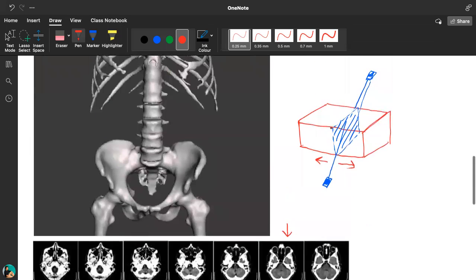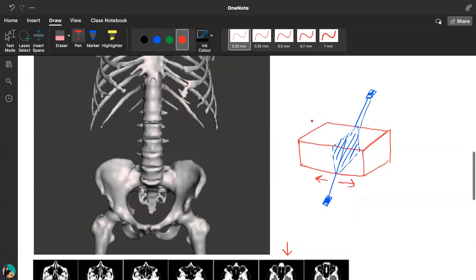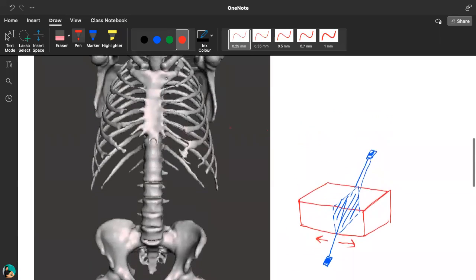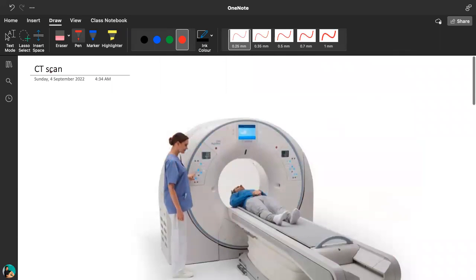Same as this one. I take every single slice, the next one, then I can form the entire solid. It's kind of like 3D printing. 3D printing builds one layer by one layer by one layer, and then overall you get the whole thing. This is what the CT scan is doing: taking many 2D images and then making them into 3D by using a computer. The word CT, computerized, the C means you need a computer to help you process the image.